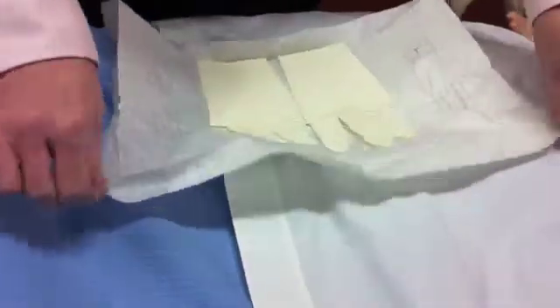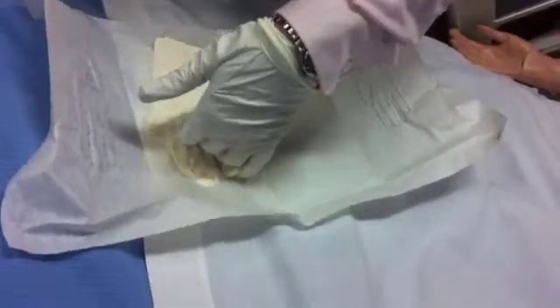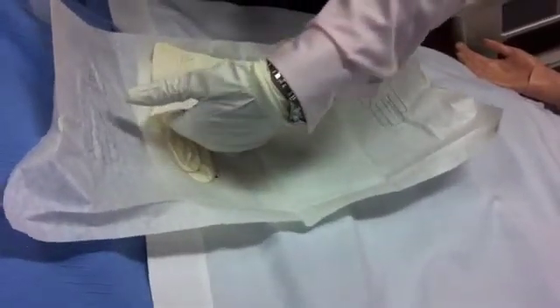Open your kit and apply sterile gloves. You can throw out the sterile field that comes in the packet and just put on your gloves.